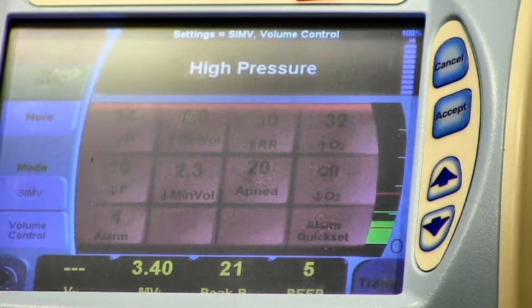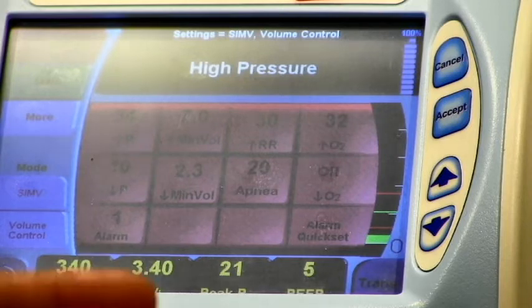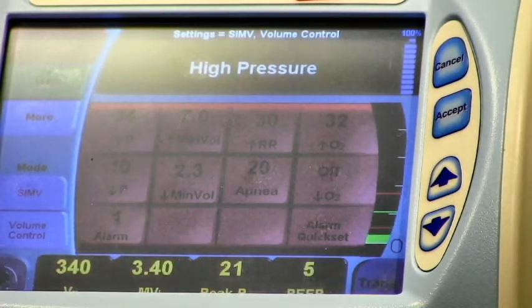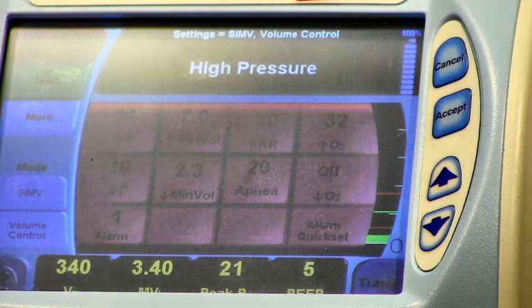And so if the patient is set on a monitor or a ventilator breathing of 12 breaths per minute, but they're breathing 16 times a minute, within a minute or two, you're going to get a high minute volume alarm because they're going to supersede the amount of liters per minute that the machine has as a high end because they're overbreathing the vent. Again, remember, minute volume is physiological need, so be careful in adjusting that too much, but look at your alarms and see why it's happening. Again, most of the time you may need to increase or decrease sedation.